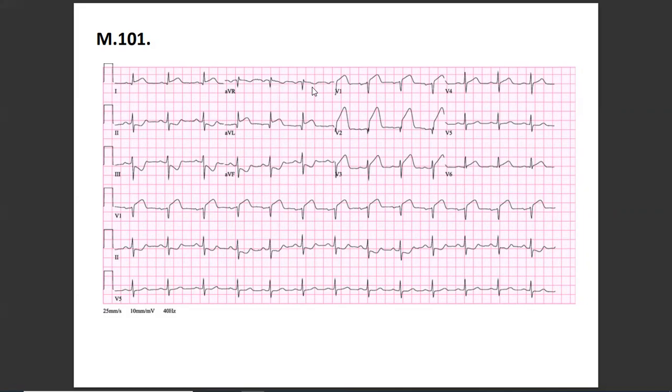Next one, the PR interval. Is it in the normal range? Yes or no? After, the QRS complex is narrow? Yes. Here I would say the axis, because when we do the QRS complex, the axis should be evaluated. If the QRS is wide, you have to think about intraventricular conduction abnormality. All right. Now, next one, you can look at the Q wave. Can you see pathological Q wave? If not, not. After, you can go to the ST elevation and the T.